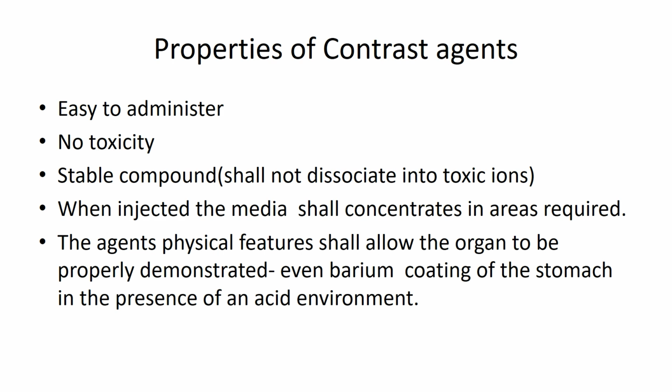It means it shall not dissociate into toxic ions, and when injected, the media shall concentrate in an area to raise the density. If it has no ability to concentrate at a particular area, the basic purpose of raising the density of an organ or tissue will not take place.